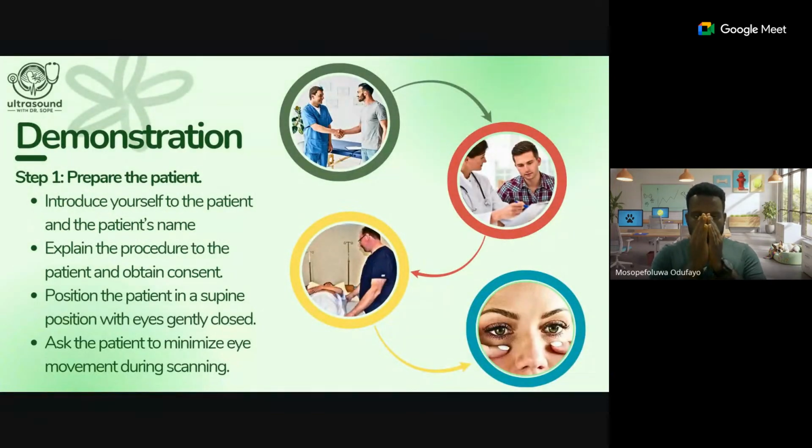In demonstrating the ocular scan, the first thing you need to do is to prepare the patient, and then a video is going to follow this particular demonstration on the YouTube page. It's going to be called Ocular Scan Demonstration. I'm going to make reference to it for those who want to see a live demonstration of how an ocular scan is done.